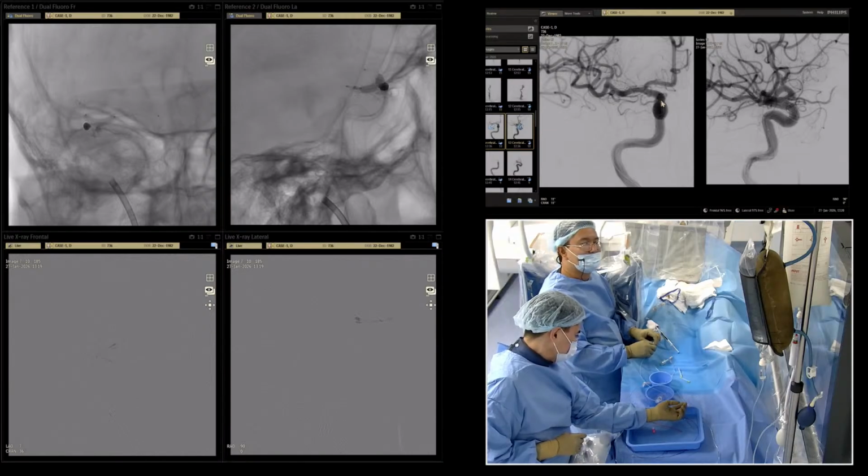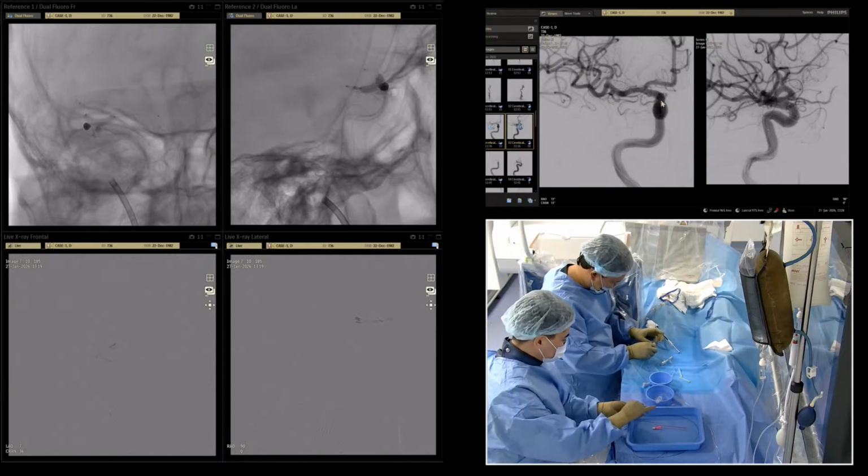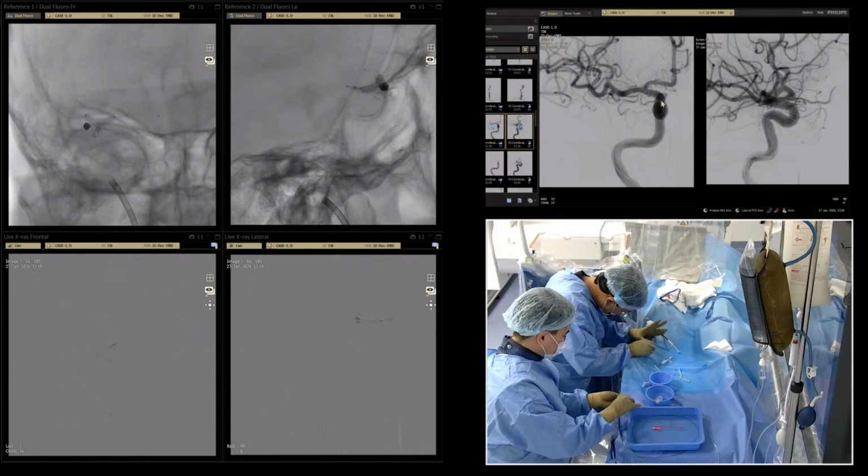Yes, it was a dissection of the orifice.